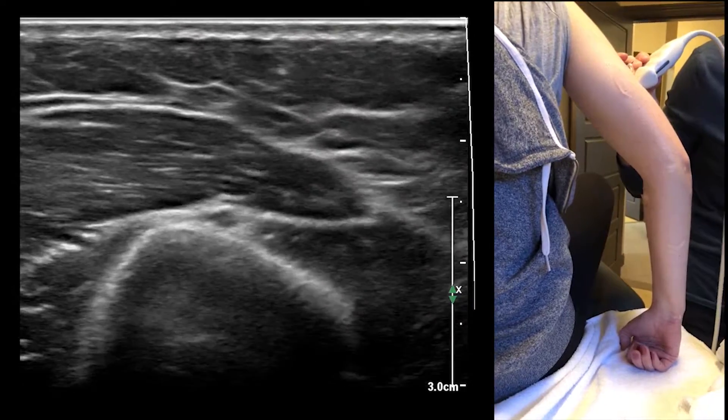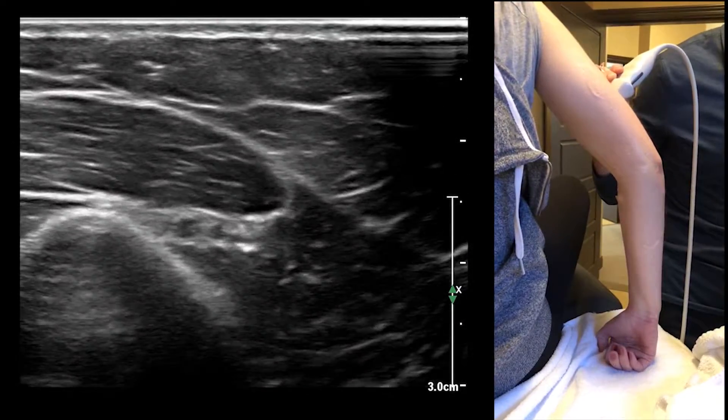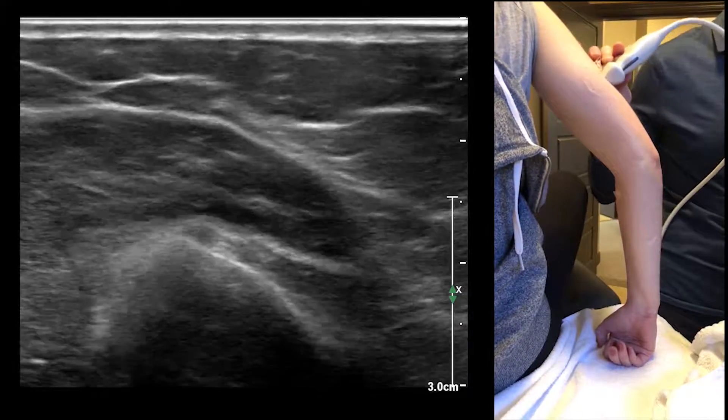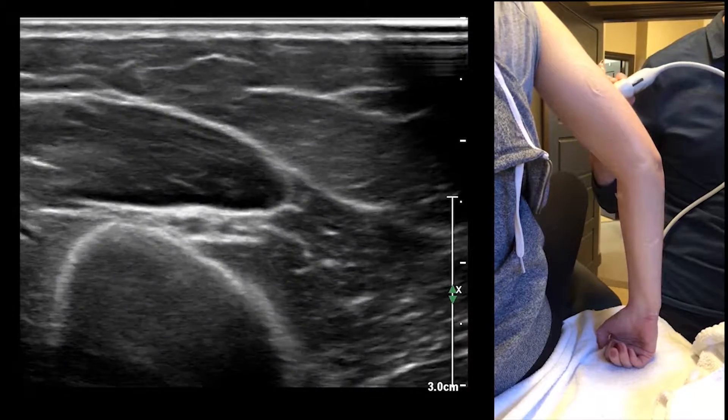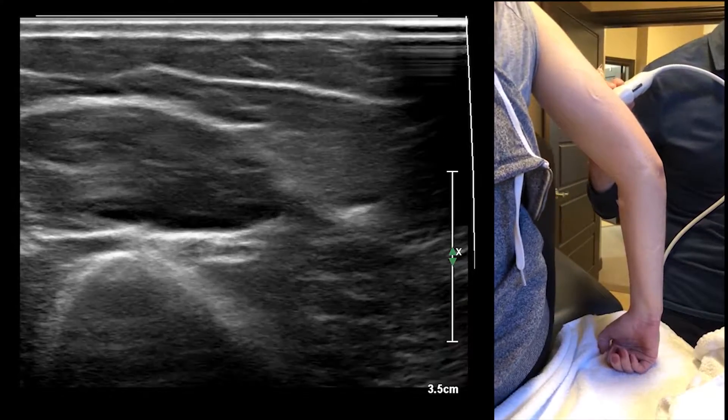I just switched over to a mid setting on this particular machine — you can do it a couple of different ways. So here is the radial nerve and artery, and I'm going to make a slight adjustment here.